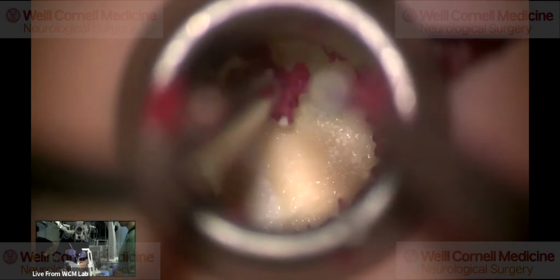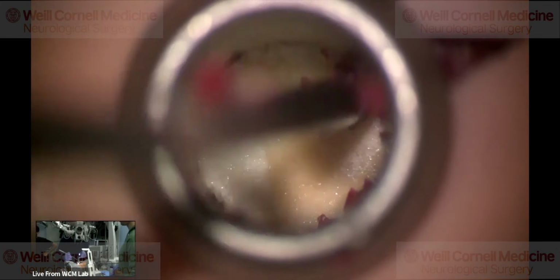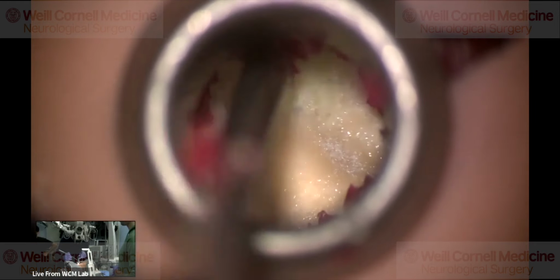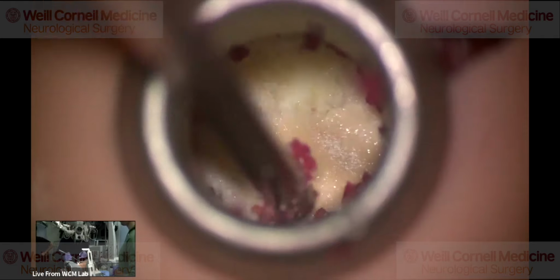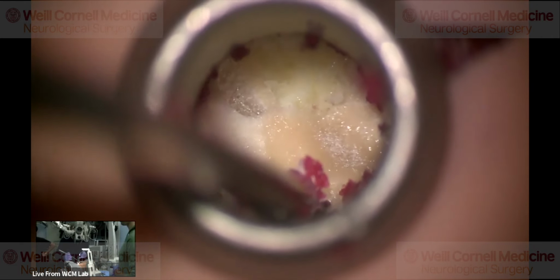I know you mentioned it, but with that view of the microscope, it would be nice if you can show us where your medial starting point is. Yeah. So cranial is here on my left side. Caudal is on my right side. Medial is here medially. The yellow stuff is the yellow ligament. Then this is the facet joint, lateral, right?